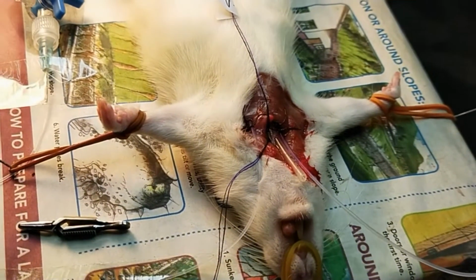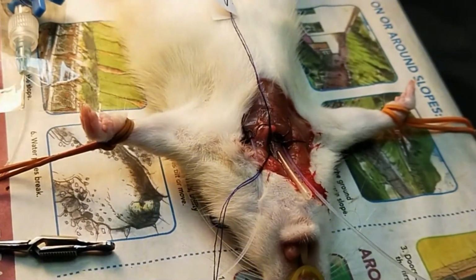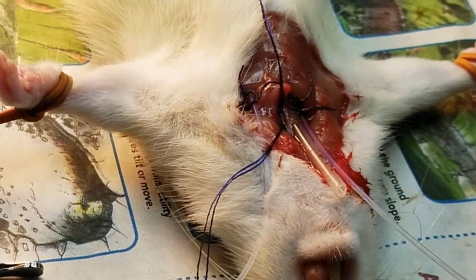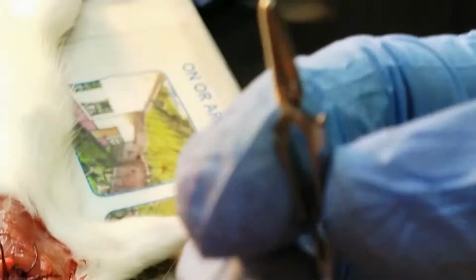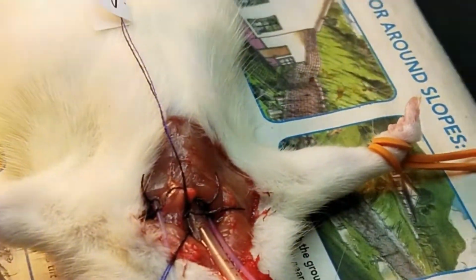So now we're going to proceed with the first parameter, which is the influence of baroreceptor. For this method, we're going to clamp the left side of the carotid artery and see whether there are any changes in terms of blood pressure or not. We're going to use the crocodile clamp here, this one.